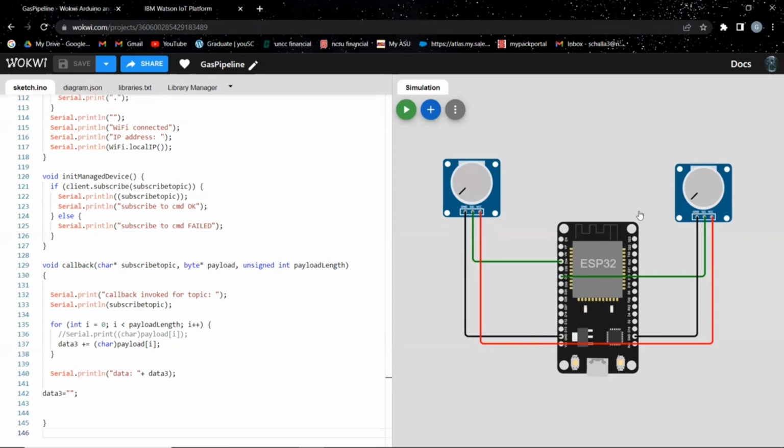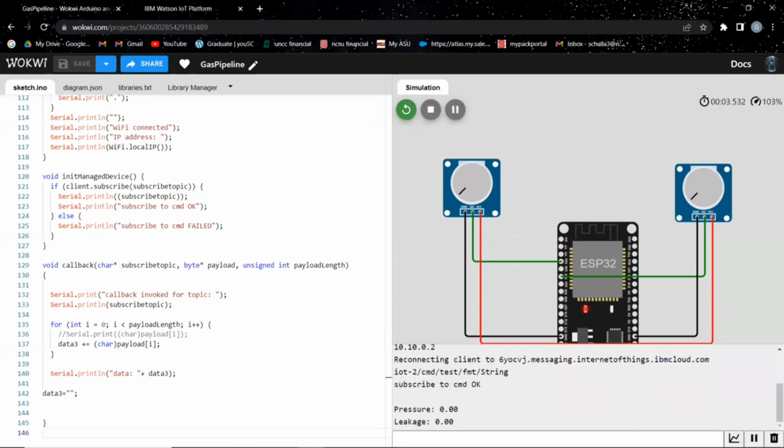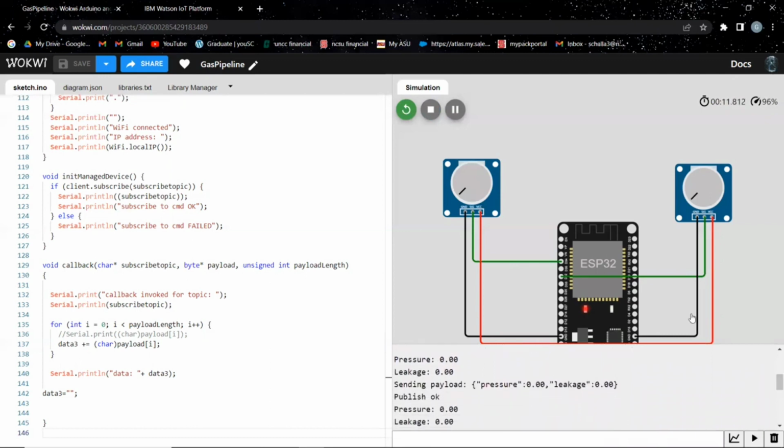After making the appropriate connections, click on the device simulation, which is the play button. We can see it is connected to Wi-Fi and the client is connected to the cloud server, and we can see the pressure and leakage values as well, and they have been sent to the cloud server in the form of a payload. You can change them manually by clicking on the dial on the potentiometer.